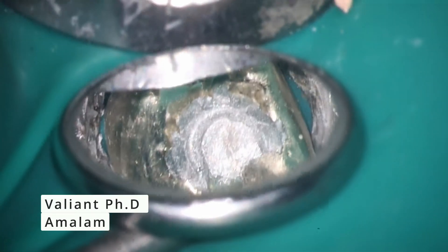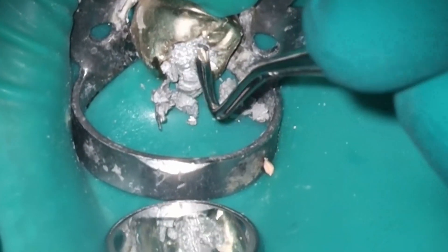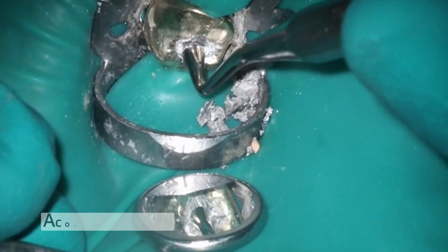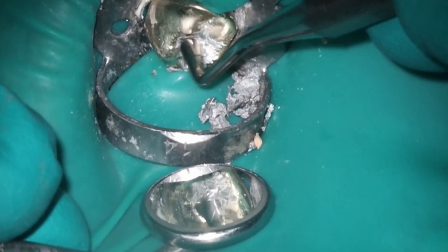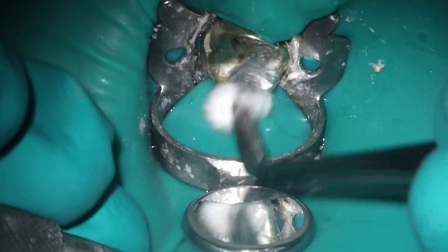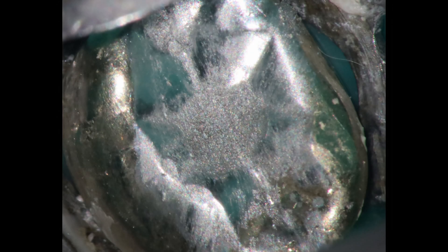We're going to seal it up with amalgam — it looks great. My amalgam skills — I have lots of friends who are in the military, so don't come after me. Most of the dentists I work with in this area prefer composite because it's easier to prep, and patients seem to be more prone to accepting it because of the mercury concerns. But for metal, I do find amalgam is the best material. I bought a thousand little cartridges a while ago and it'll probably last me my whole career. Finishing off with a cotton pellet just to make sure we don't have any excess. That's what the final looks like — really nice and skinny as far as the end result.